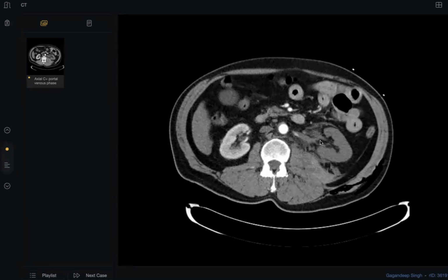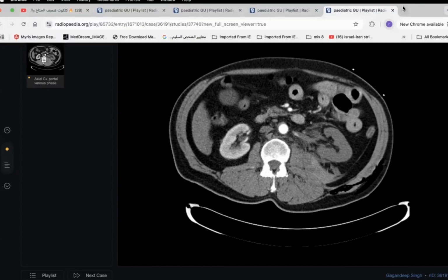I am also speaking about this limited study because, by the way, my colleagues, do you know many of the examiners will give you a static image? I forgot to tell you, many. I think 50% of the images will be static. See, 40 to 50% will be static and very clear. You will find one, two, three, especially the first cases.